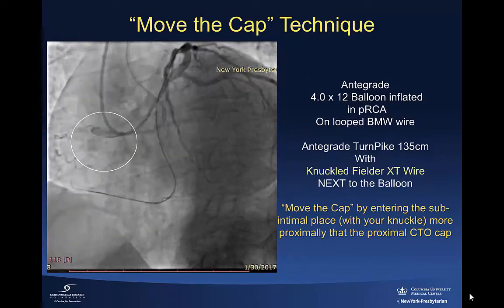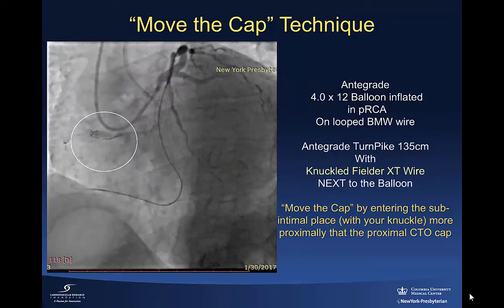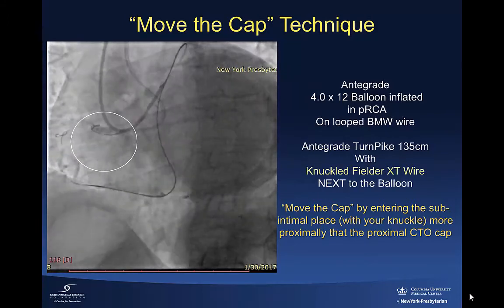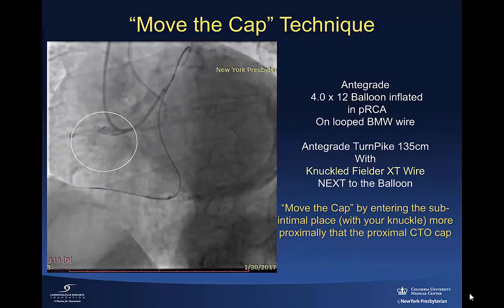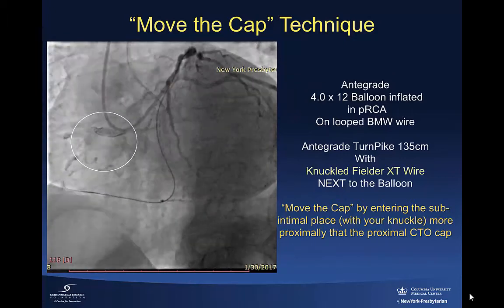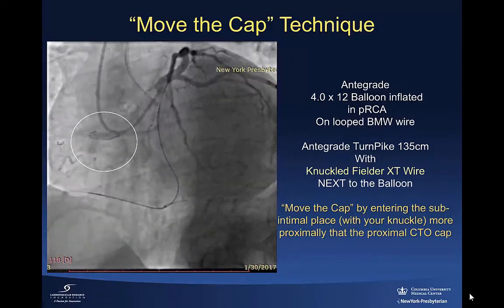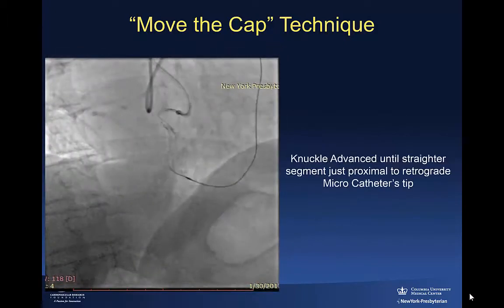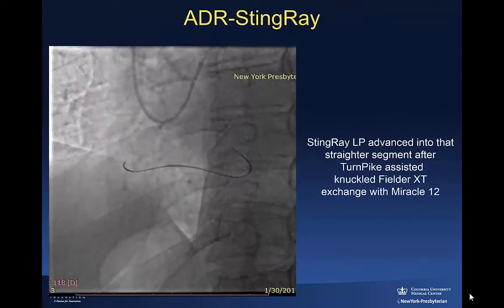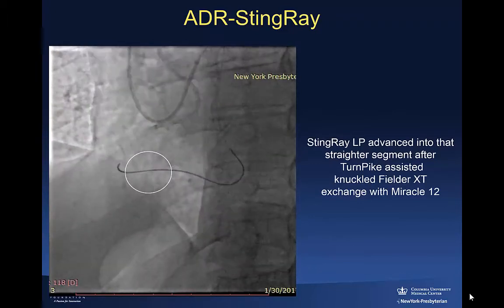The way it's done: you have two systems in the proximal part of the artery — one wire, and then an NC balloon sized appropriately to the size of the artery. You inflate it at a relatively high atmosphere, 16-18, and then you pin the microcatheter in the mid portion of the balloon, as you see in the circle. That stabilizes the microcatheter and pushes it towards the wall. It works better in diseased areas of the vessel. Then you take a Pilot 200, put a 1mm 60-degree bend, and push — 99% of the time it will get into the sub-intimal space. It will form a knuckle, as you see here, and we confirm in orthogonal views.